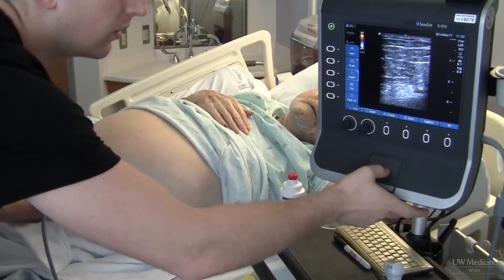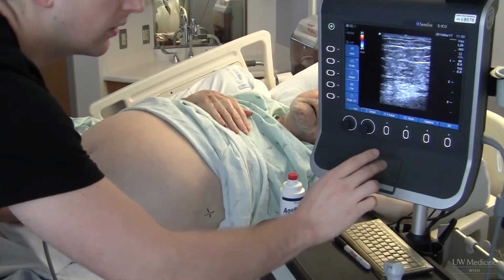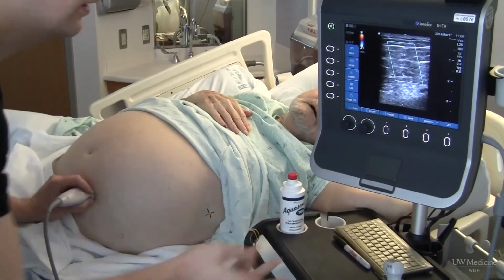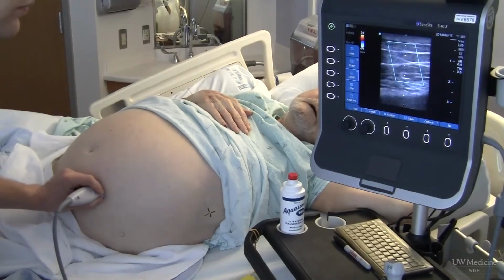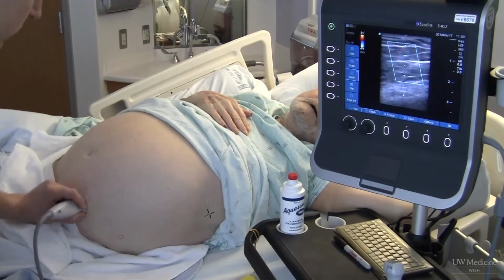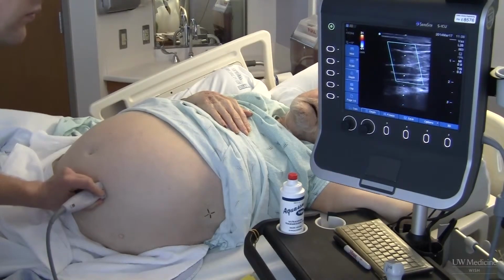If possible, identify the inferior epigastric artery along the edge of the lateral rectus sheath. At a minimum, you should examine the area of proposed needle entry. Note that a color Doppler signal will not appear when the probe is perpendicular to flow, and so this evaluation must be performed with the transducer at an oblique angle.